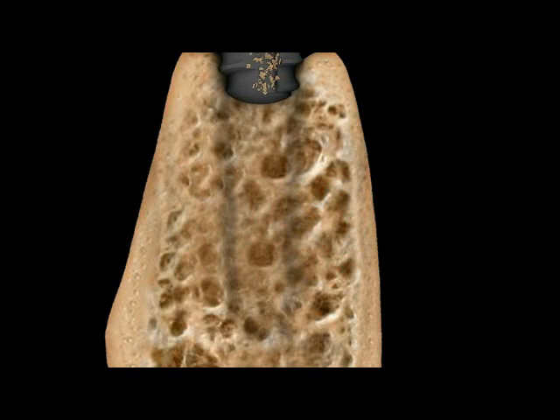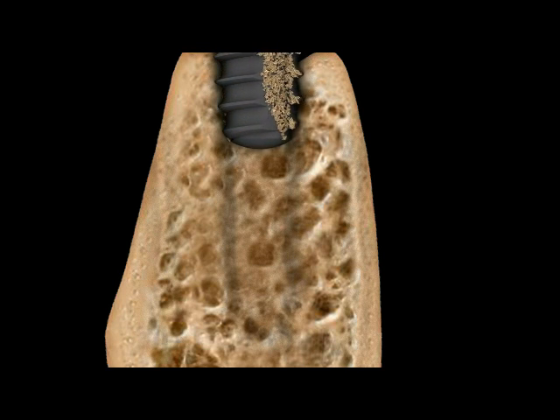In an effort to eliminate a separate bone tapping procedure in the preparation of an osteotomy site, tapping segments were added onto the body of what are termed self-tapping implants. But is this the optimal configuration for a self-tapping design?